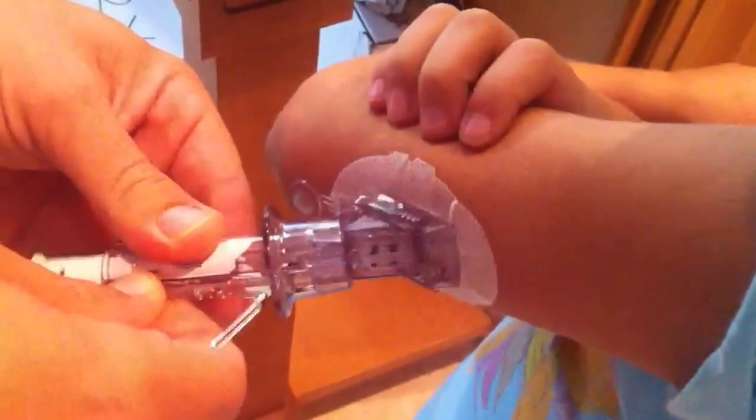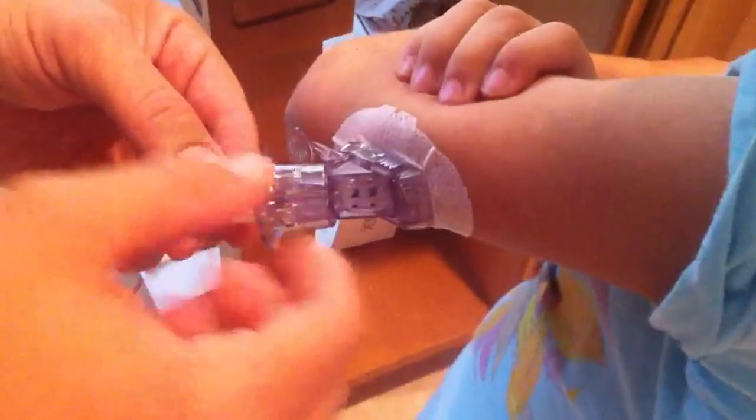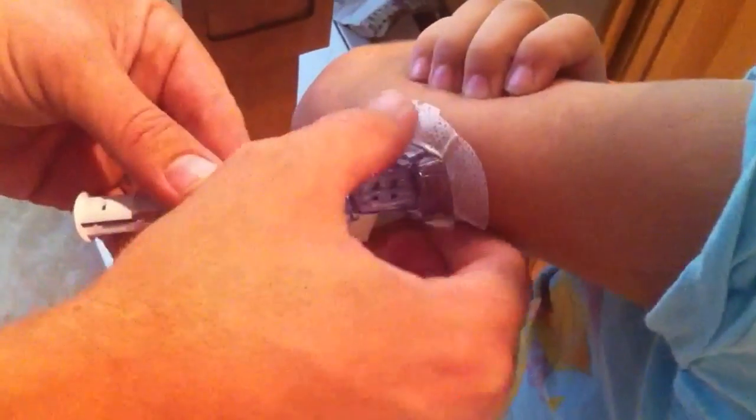Take the safety off. Safety off. Now we're going to insert the needle, and then pull the needle out. The needle will come out and leave the wire inserted under Ella's skin for seven days.